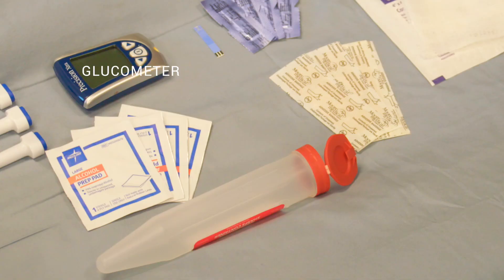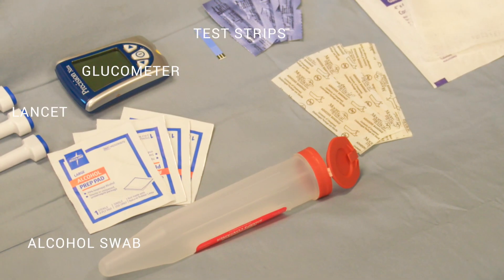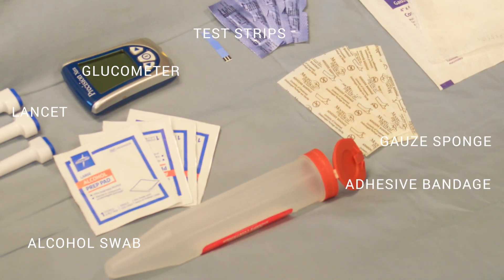The materials I'm going to need for this skill include my glucometer, my test strips, a lancet, an alcohol swab, a 4x4 gauze sponge, and an adhesive bandage.